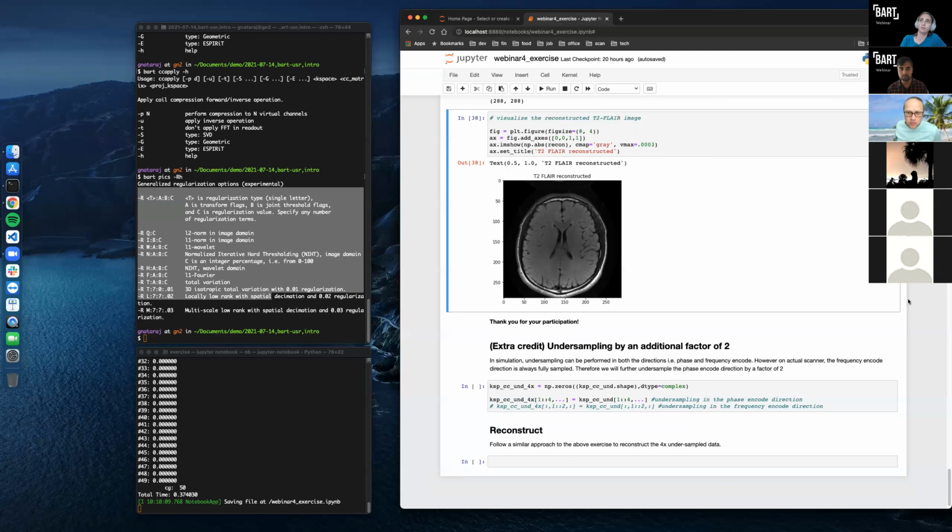You can run a diff on whatever command or commands are causing an error. And if even that is not helping, it might be a very detailed issue, and the last resort is to examine the source code, which is all accessible as well. So that's the order in which I would try to debug that. But it's probably something minor that you can figure out from the release notes or a diff.